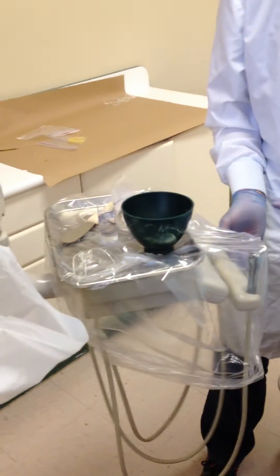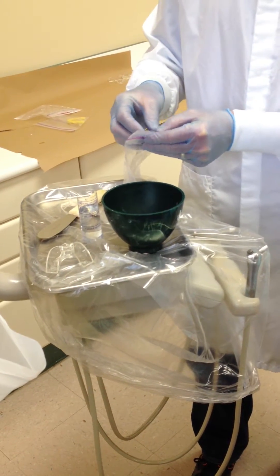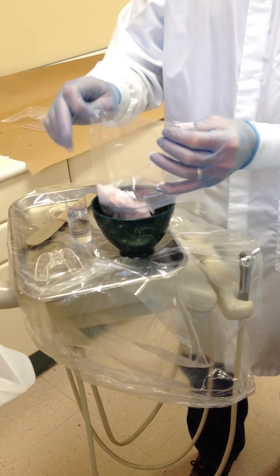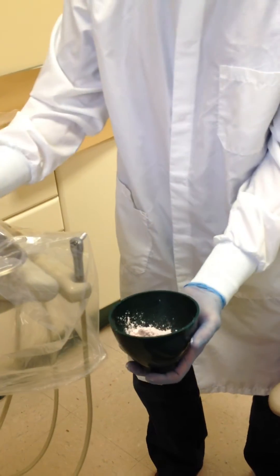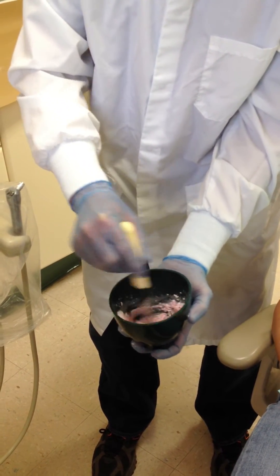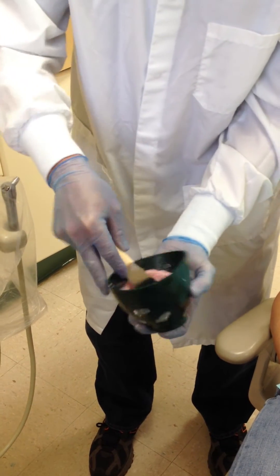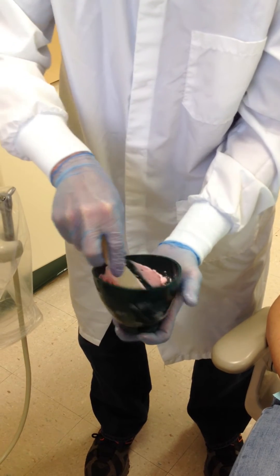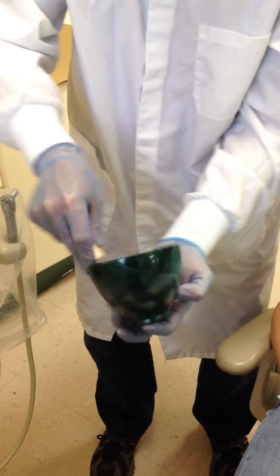We have our same material — we have our mixing bowl, our tray that we have fitted in advance, our water and our powder. We will add our powder to our mixing bowl, then add the water to our powder, mixing slowly at first to incorporate the powder into the liquid and not get it all over the operatory. Once we have it incorporated, we will mix more vigorously to eliminate the air bubbles, then swooping around the bowl to gather our material.